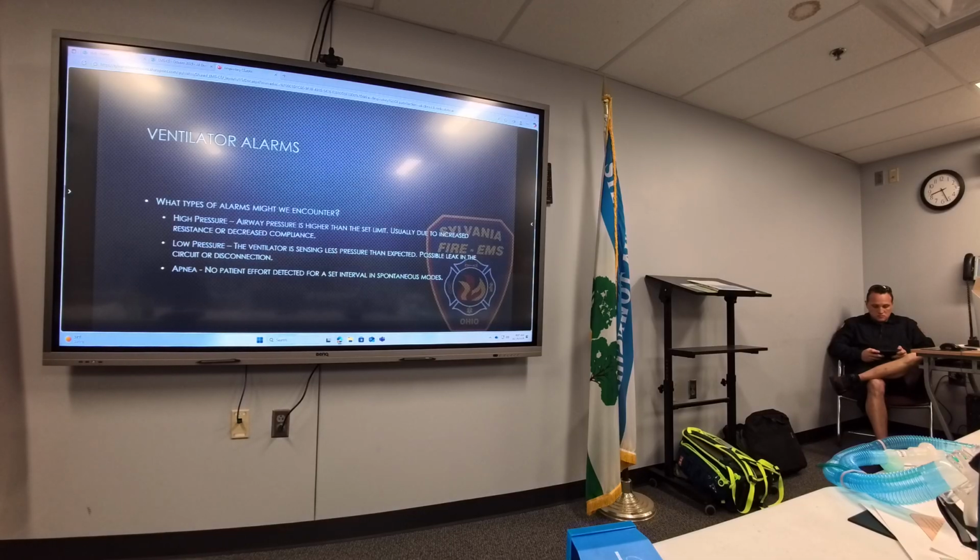Once again, this is just me. I've noticed since I've been here that we like to use these vents during CPR. In my almost 20 years in hospital, out of hospital, the flight, wherever, as soon as somebody goes into cardiac arrest, Kelly, what's the first thing we do? We pop the vent off. Bag mask only. Old school BVM, whether that's through a tube, an i-gel, or just BVM with a mask. And I've seen it before, Zach. I think we were on that one code. I don't know if it was your district or ours, but it just kept beeping and alarming. So we popped it off.